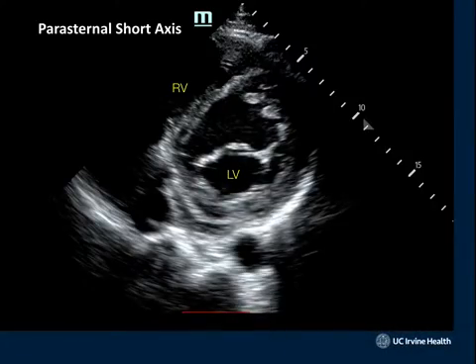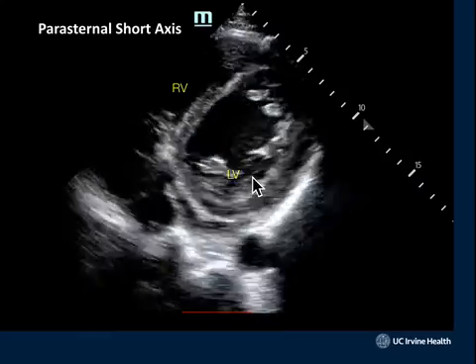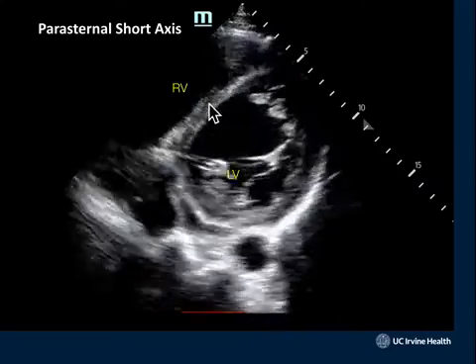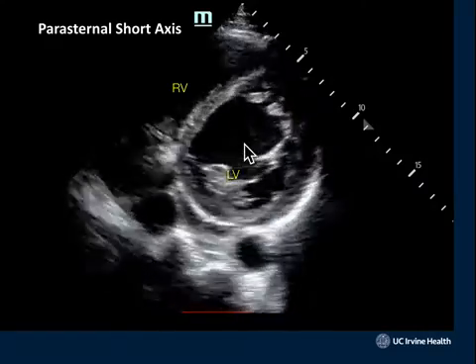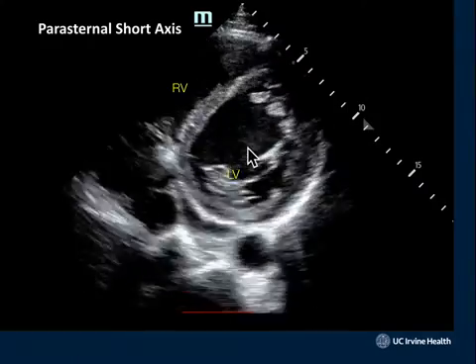Now, just another example here of the short axis down at the level of the mitral valve, aka fish mouth view, and we can see all the way around this heart. Here's the septum up here. We're not getting a lot of good contractility as opposed to what we saw in those previous hearts. It doesn't have that really nice squeeze to it, but it is symmetrical, and this would be the center of the donut.